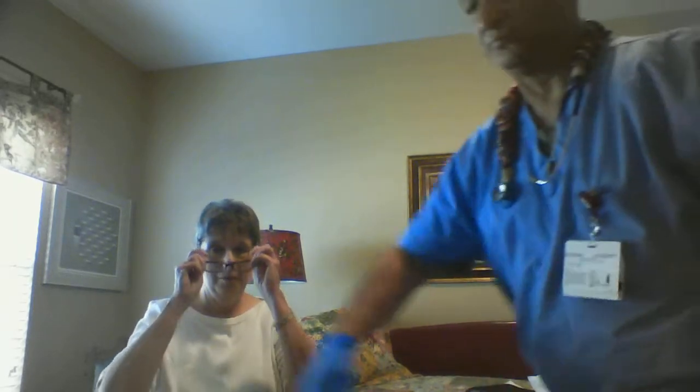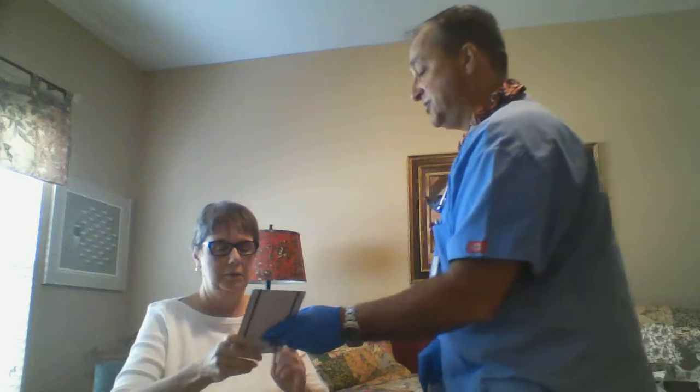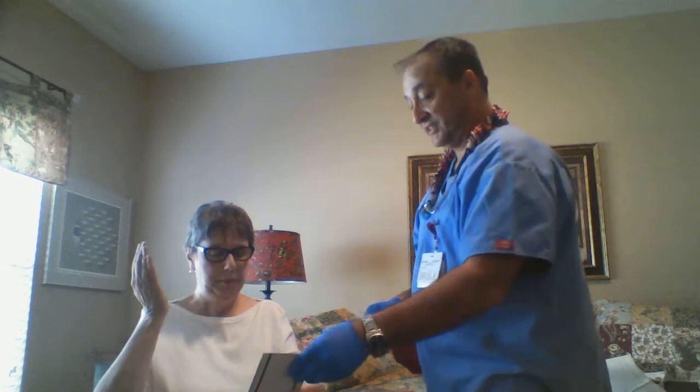All right, next thing we're going to do is just check your vision. So you can put your glasses back on. Okay. I won't see without. Yeah. You're going to hold this about 14 inches away and cover your left eye. And you're going to read the last row that you can read. LTFPH. Okay, that's 20/20. Go ahead and cover your right eye and tell me the last row that you can read. LTFPH. Okay, good. That's the Snellen chart.